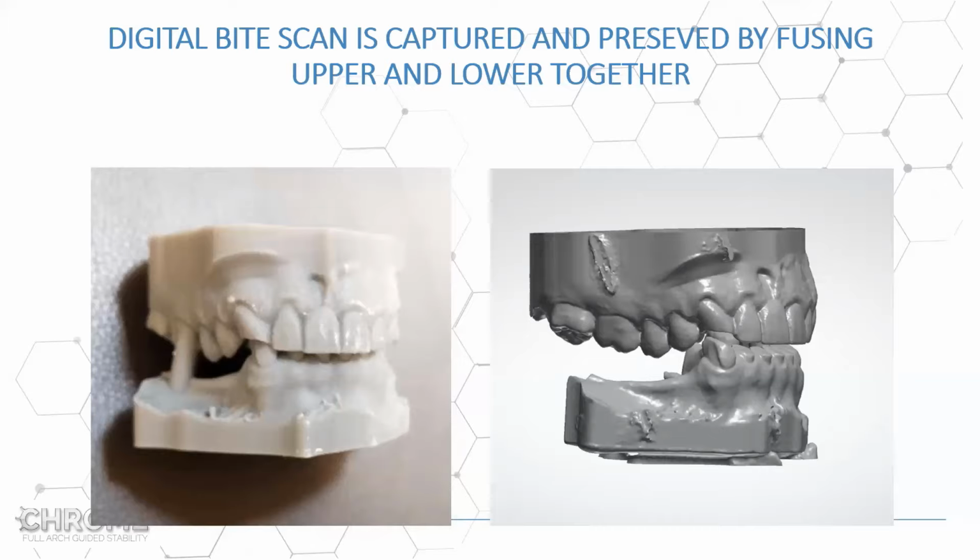And we also look at photographs to see what the patient looks like, where their anterior teeth are. Can we open this bite without having to move the incisal edge position, if the incisal edge position in their photographs looks good? So things like that we get concerned with ultimately lead to a better case.